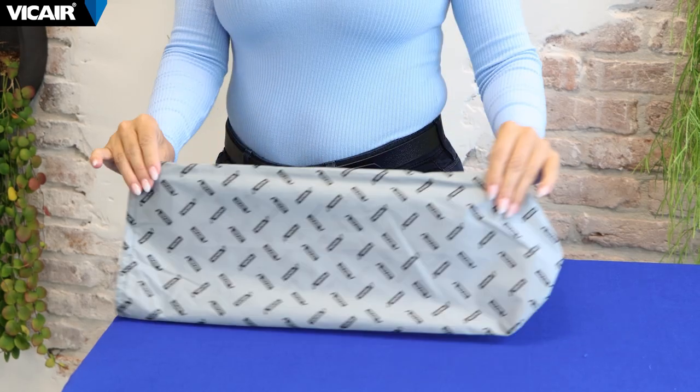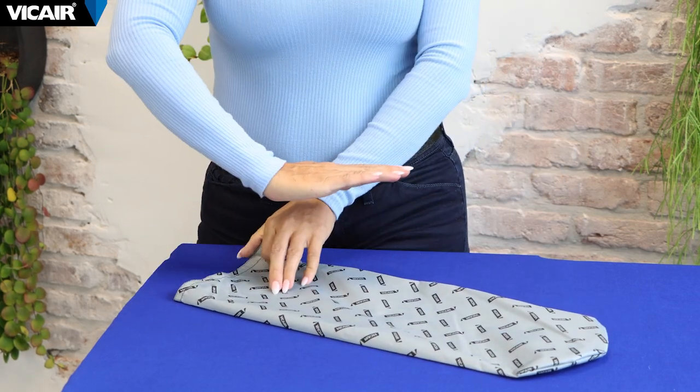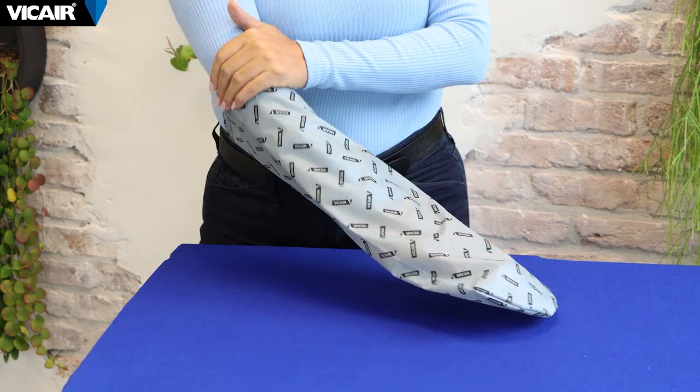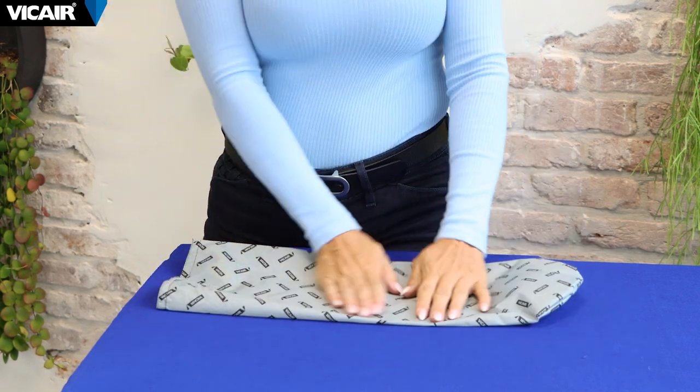The vCare slide glove is a valuable tool for assessing bottoming out on a cushion. This slide glove has a smooth material that easily facilitates checking for bottoming out. Let's go through the steps together.